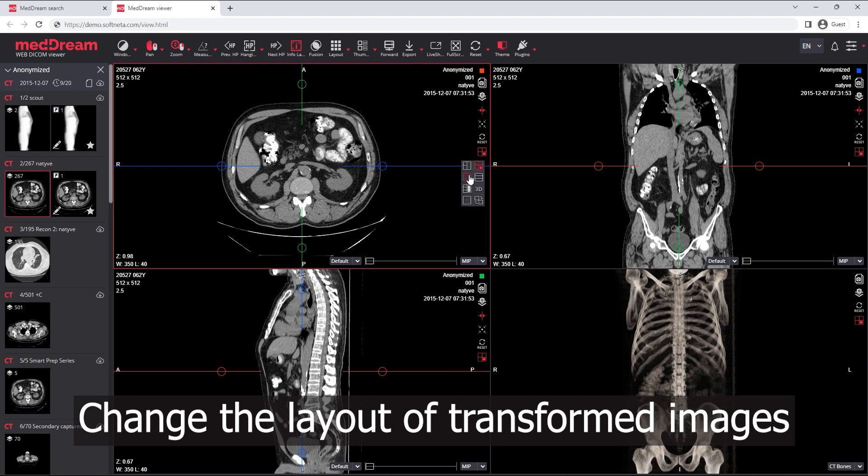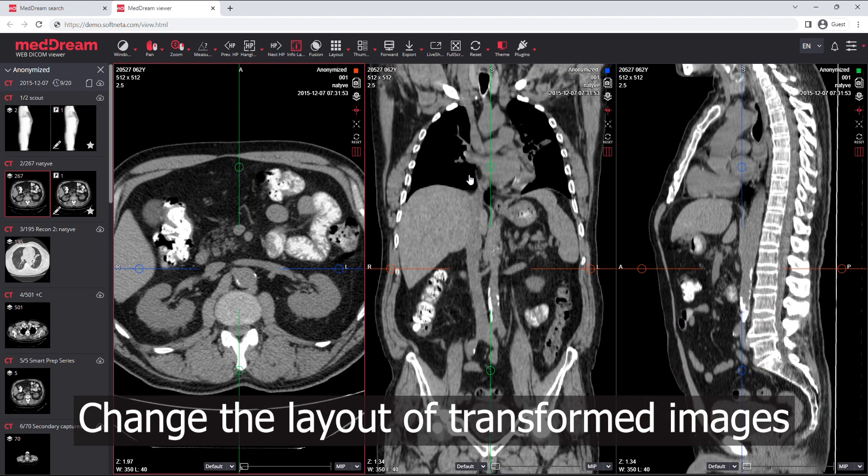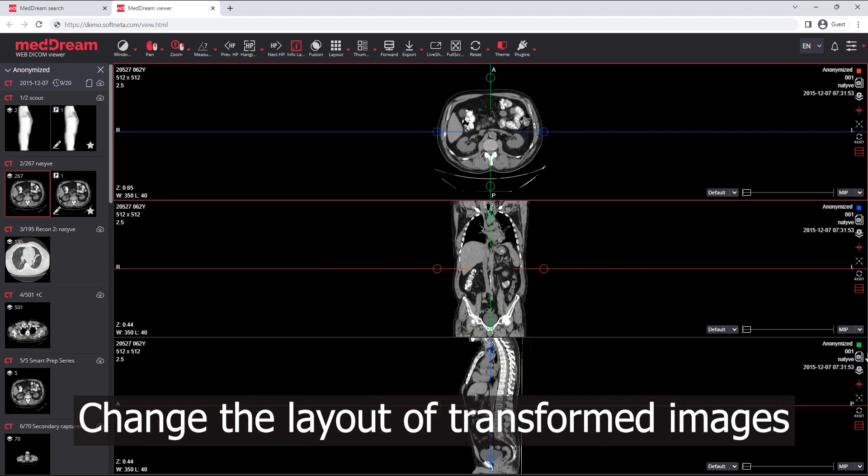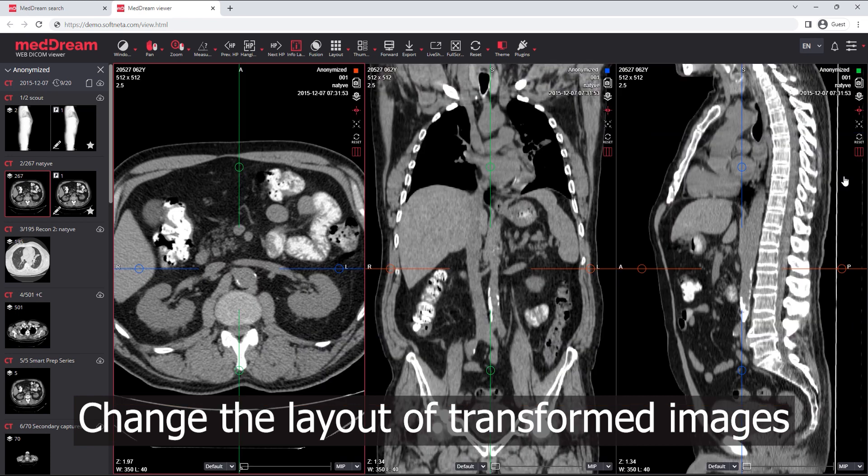Change the layout of transformed images. Action button changes to the icon according to the selected layout.